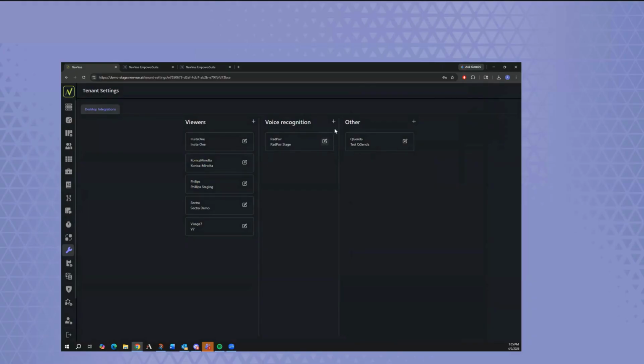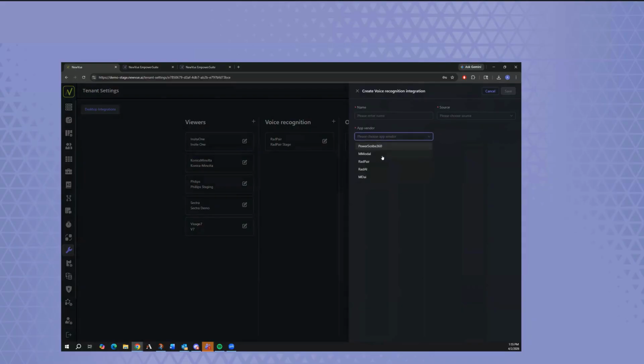And one of the things that is important here, so if I want to set up, say, a PowerScribe, I give it a name, PowerScribe from General Hospital, and I choose what exams are associated with that. So I can say the exams coming from this RIS or this EMR, launch this PowerScribe, and the exams from this RIS, launch Fluency. There's no problem with that. But it's also easy to change. If you want to swap in and out a reporting application, all you need to do is associate that integration to those orders.